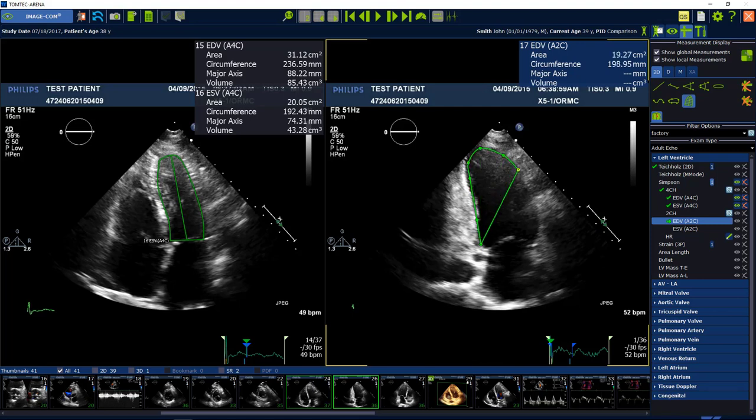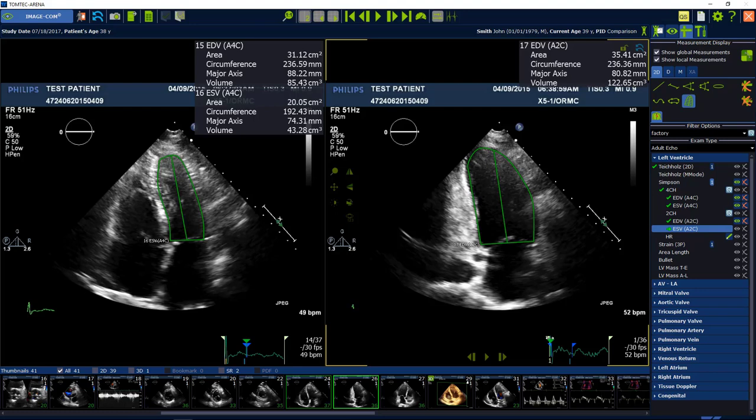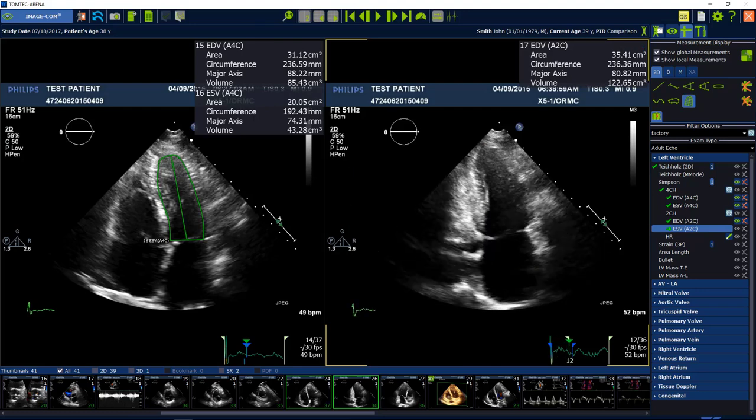The procedure of measurements can be cancelled at any time by hitting the escape button on the keyboard.